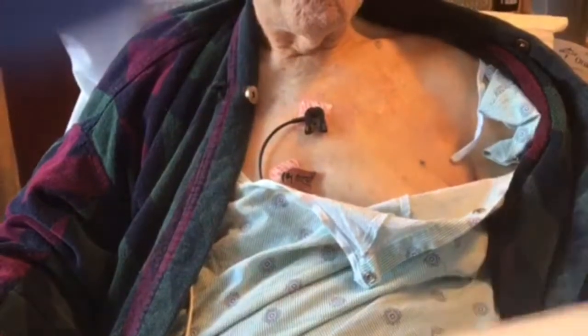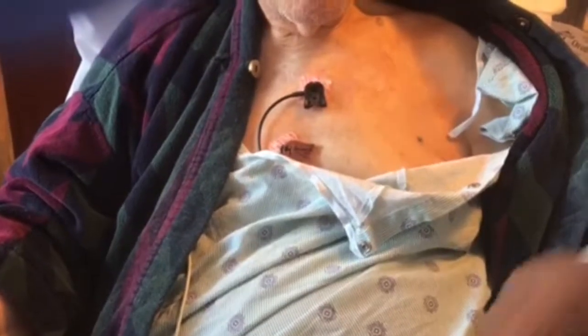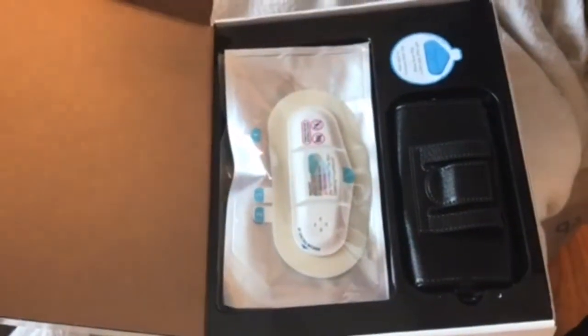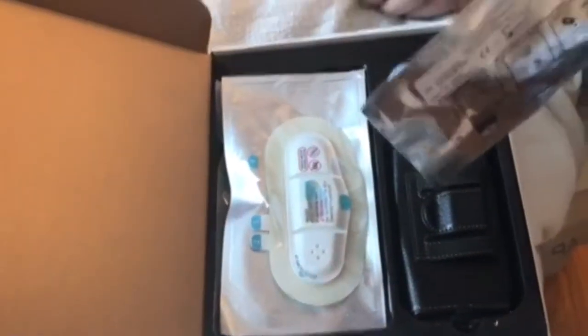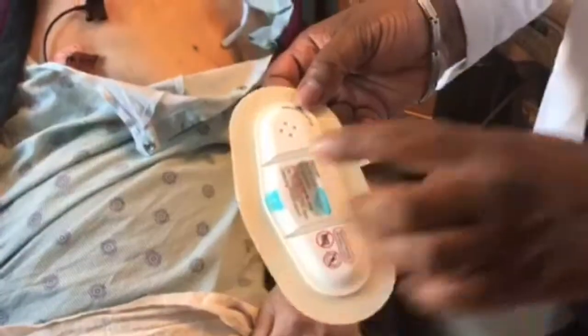So when you open the kit, we have four patches in here. The kit is set up for four weeks but we're only going to do it for two weeks. I'm going to open the patch and you see it's labeled one, two, three, four.